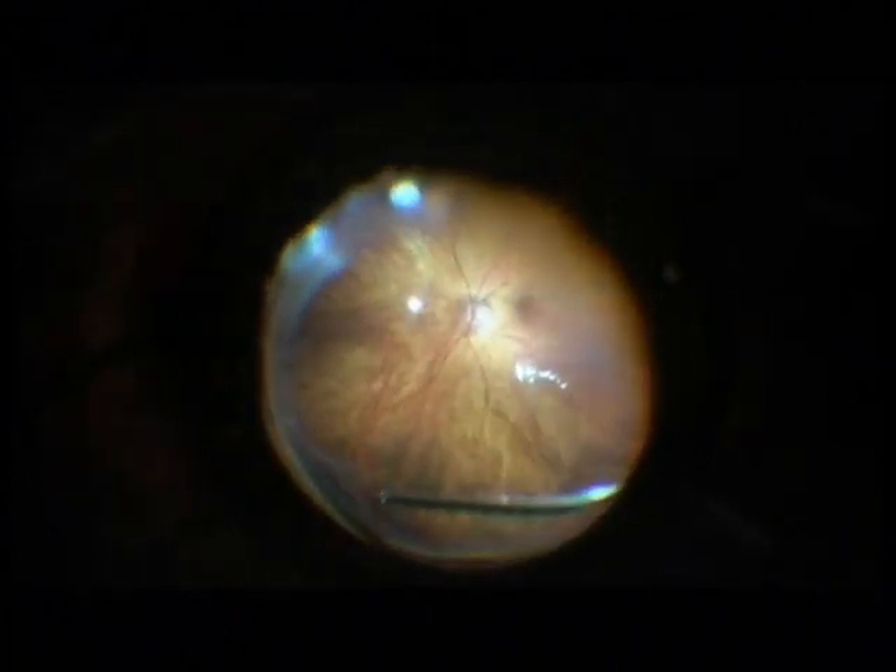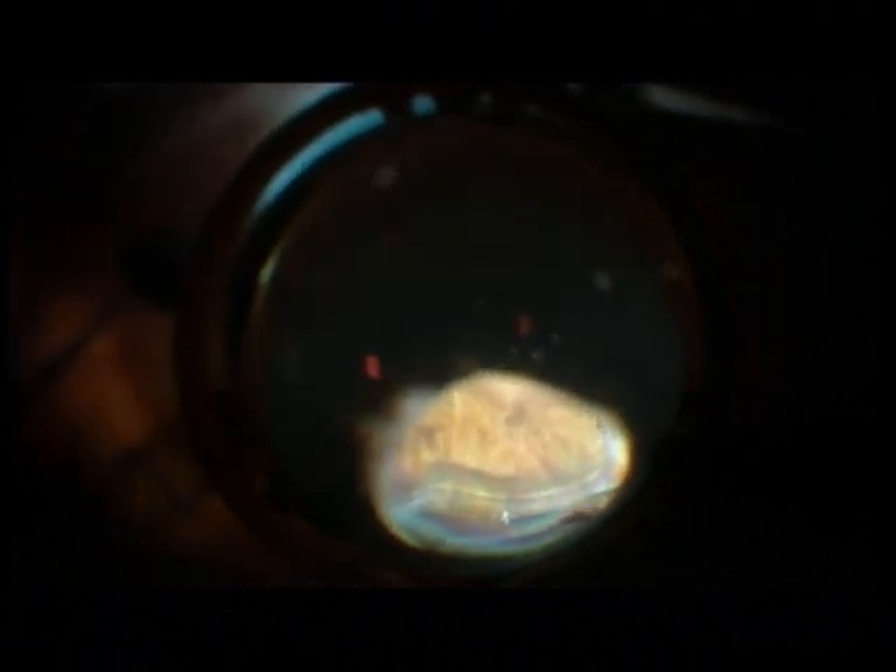Now some shaving, which is very nicely visualized under perfluorocarbon, because the residual vitreous detaches from the perfluorocarbon.